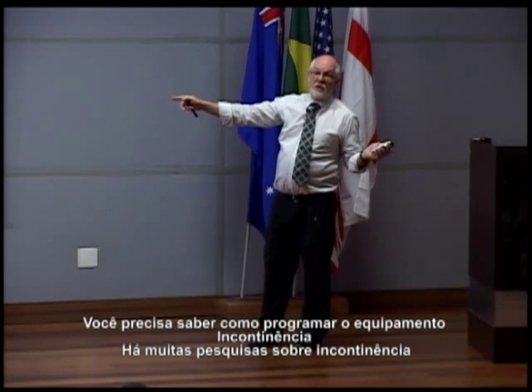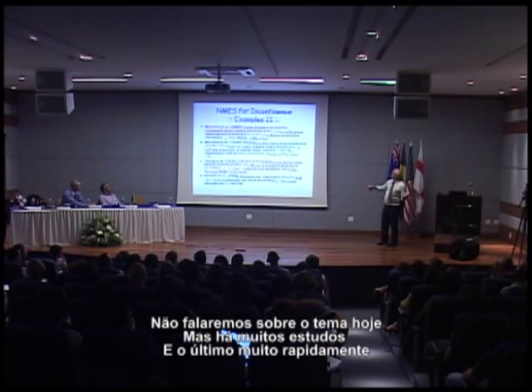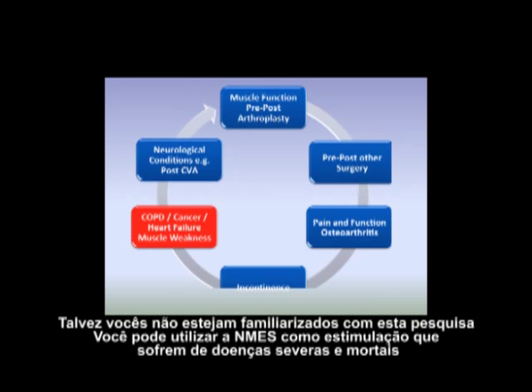Incontinence, lots of research on incontinence, which we're not doing today, but there's lots of it there. So the last ones, very quickly, and these you may not be familiar with this research. You can use NMES as a stimulation to help patients who have severe end-of-life disease.